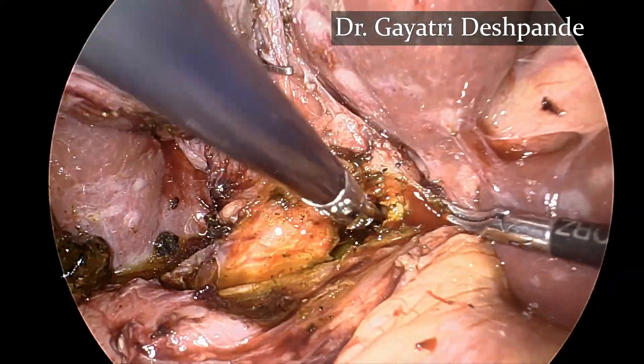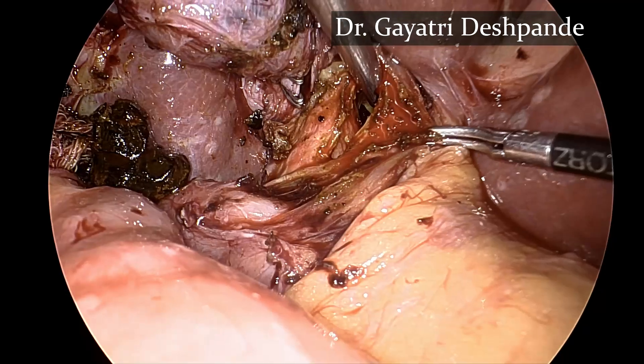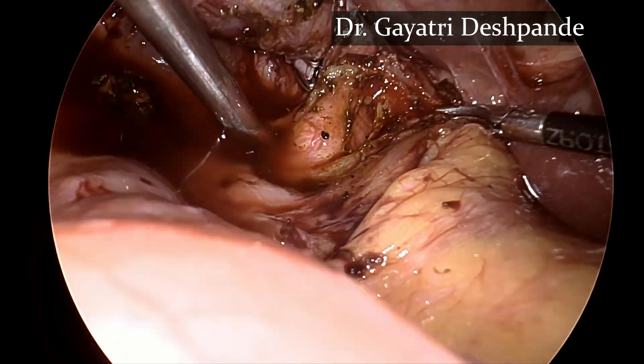The previously placed stents were identified and the biliary duct was completely irrigated to clear off all the sludge.